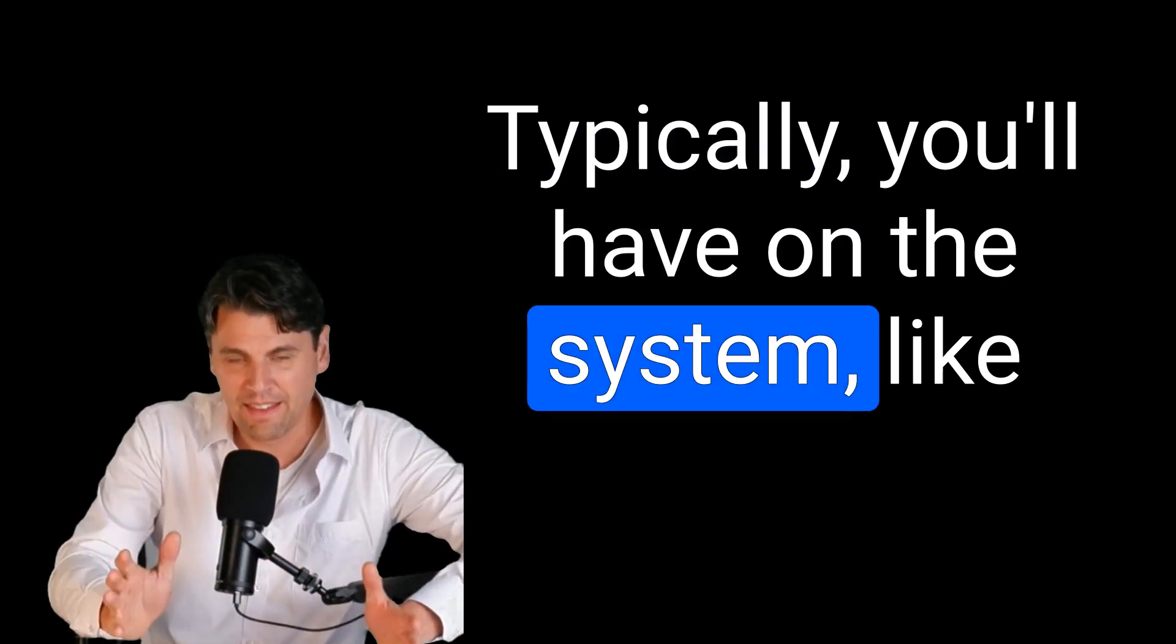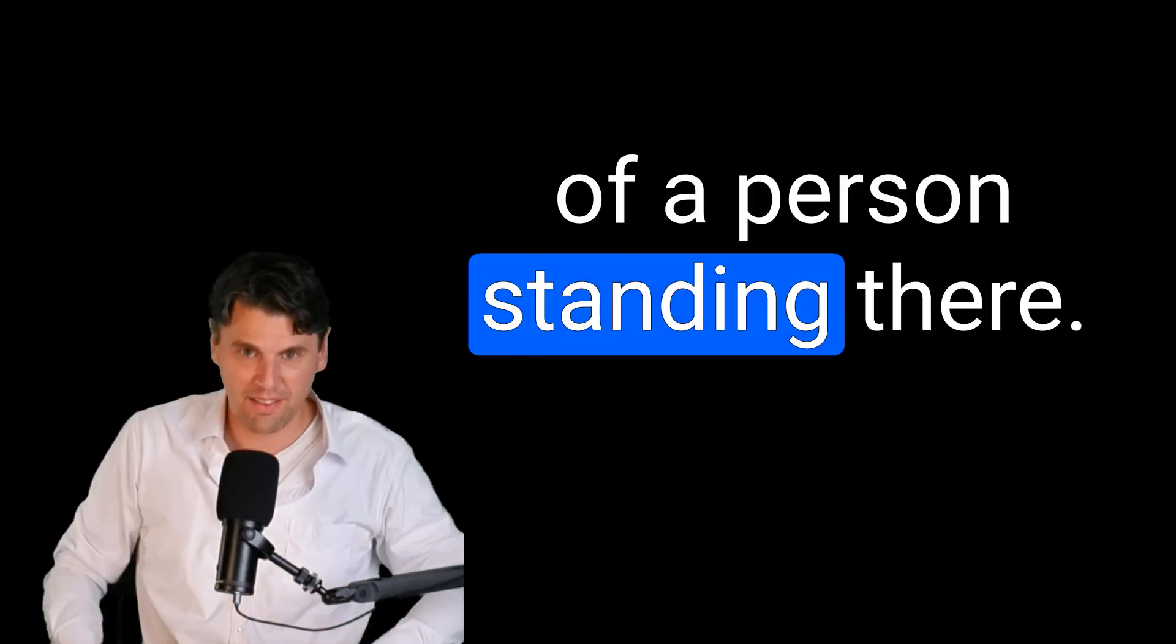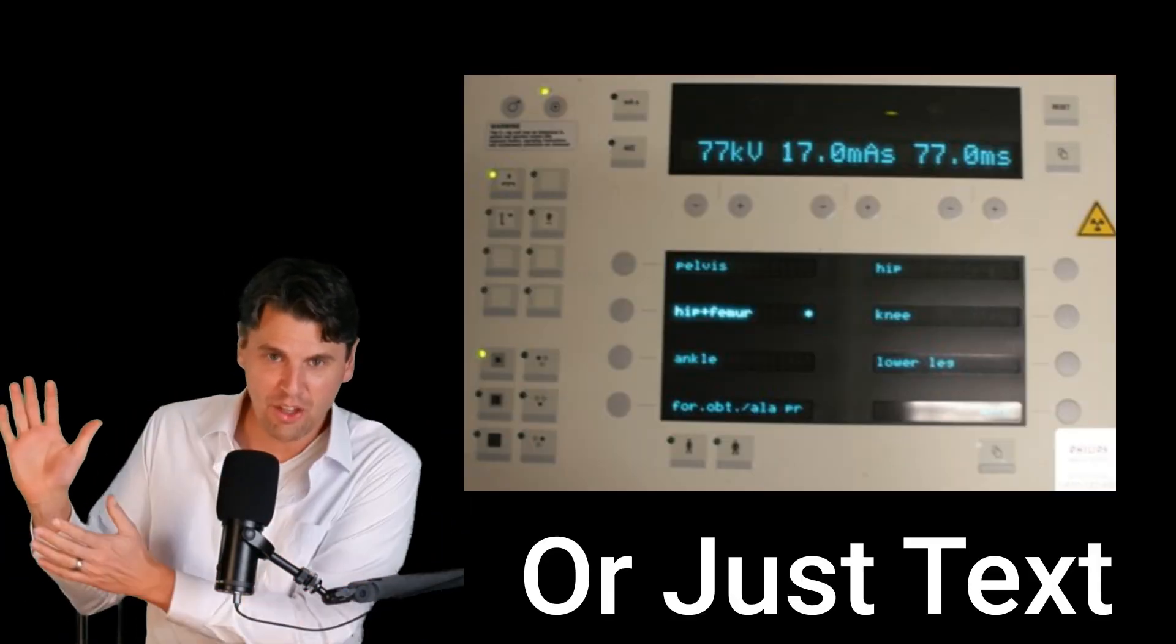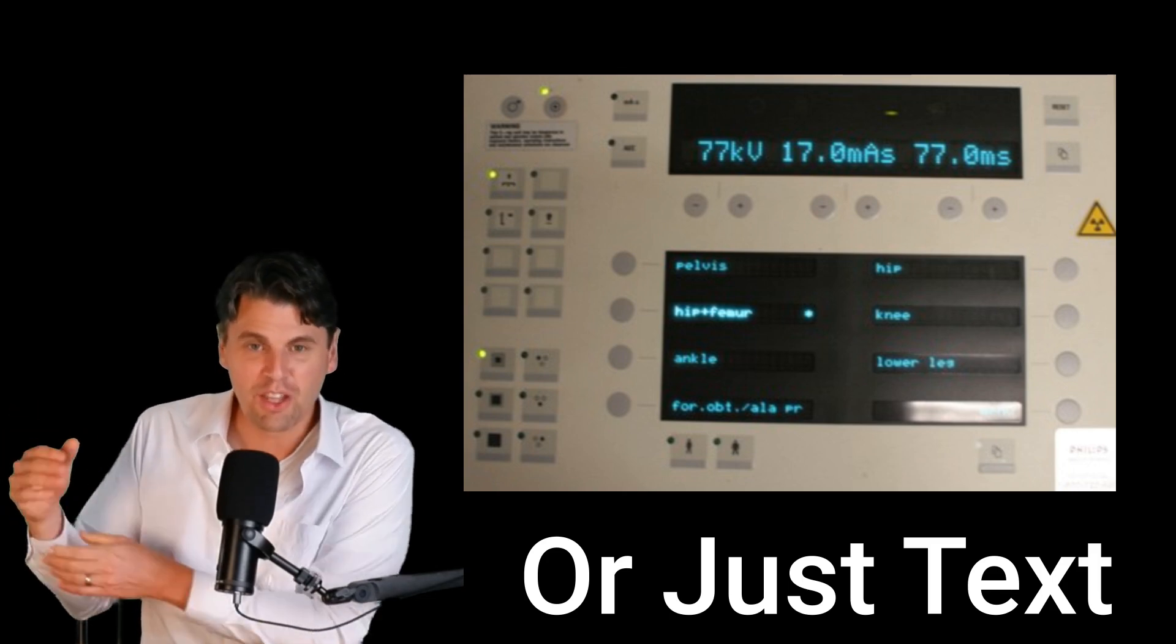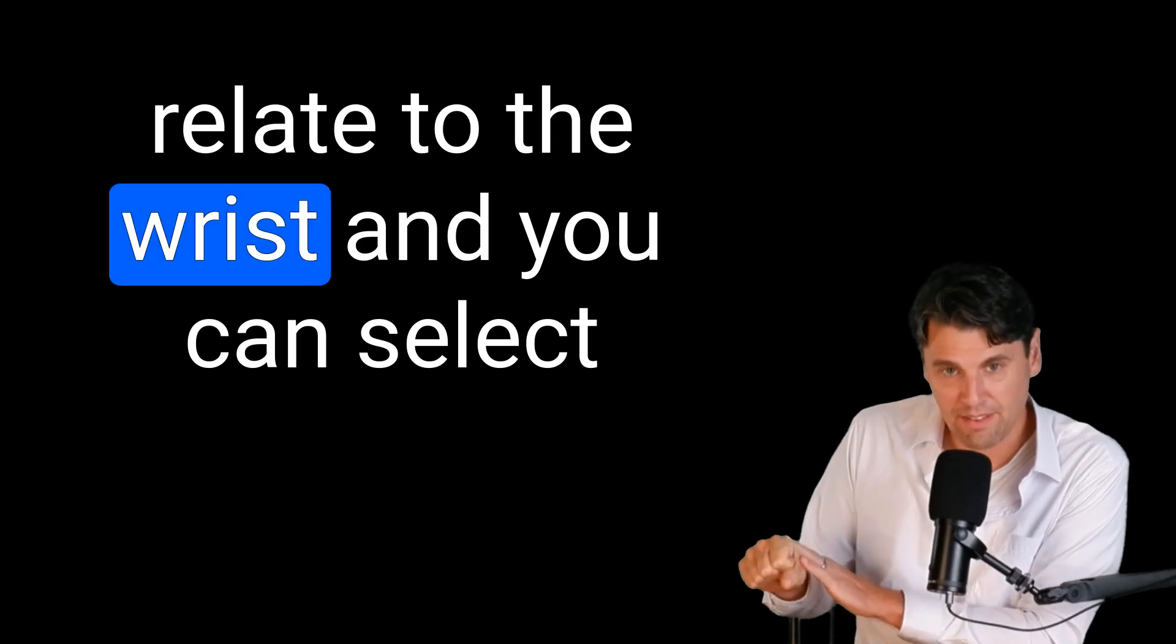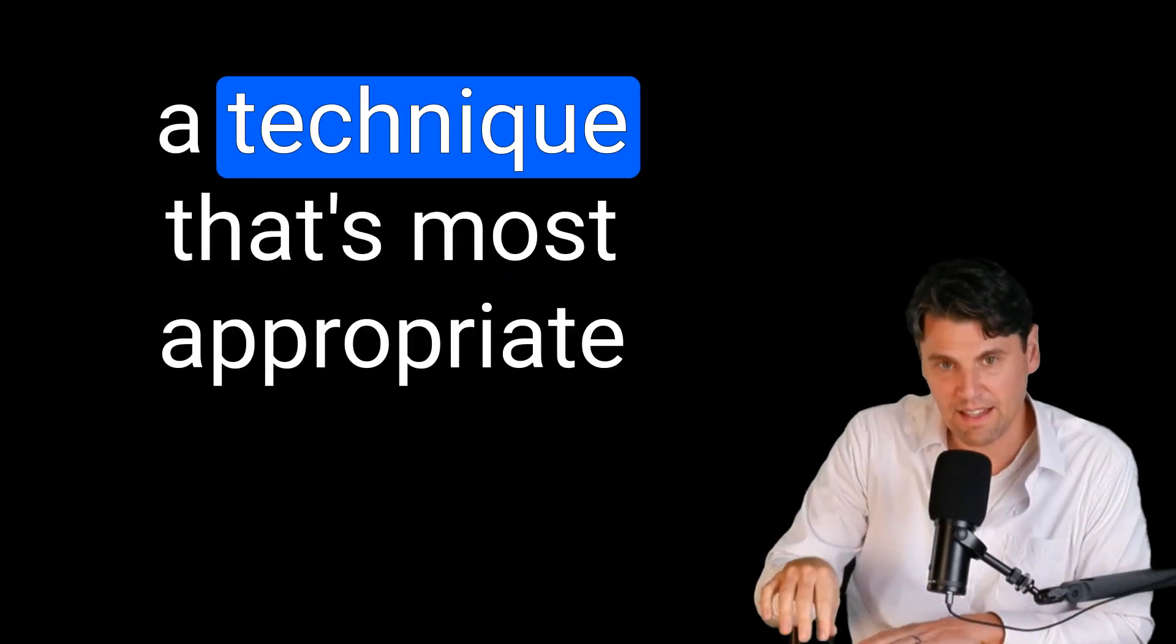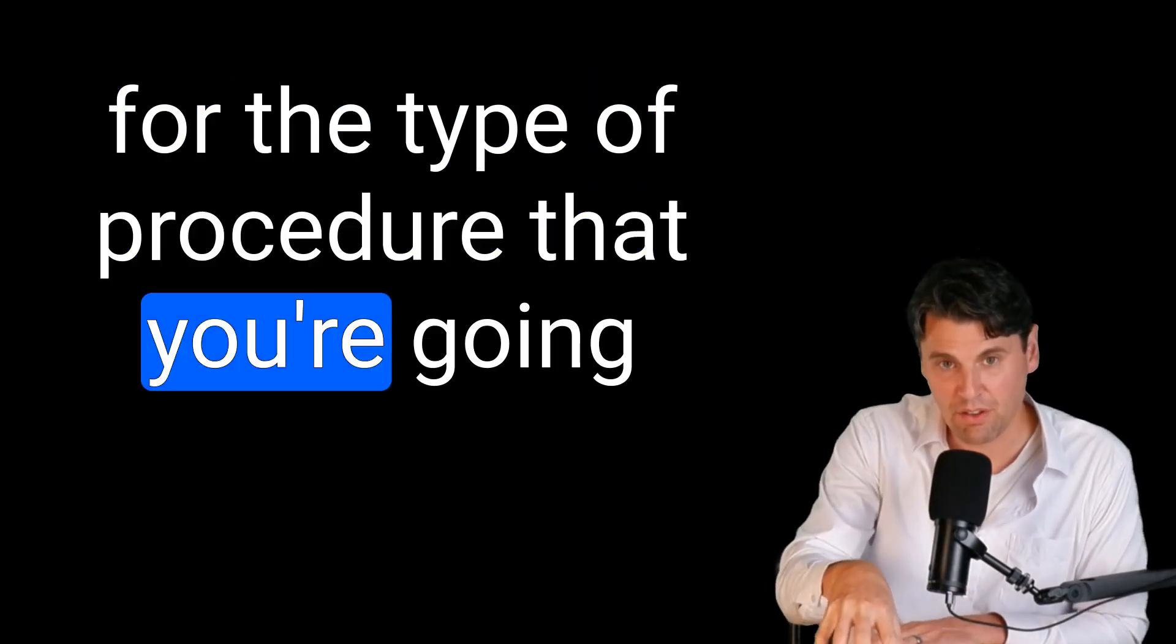Typically, you'll have on the system a graphical representation of a person standing there, and then you could click on that person. And if you click on the wrist, you'll get a set of techniques related to the wrist, and you can select a technique that's most appropriate for the type of procedure that you're going to be doing.